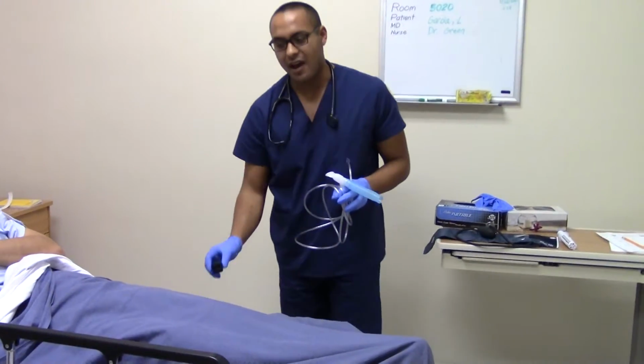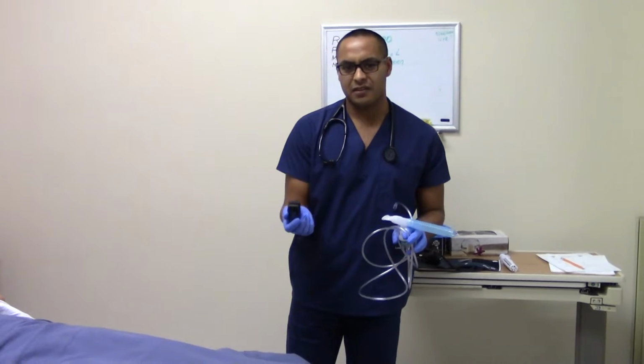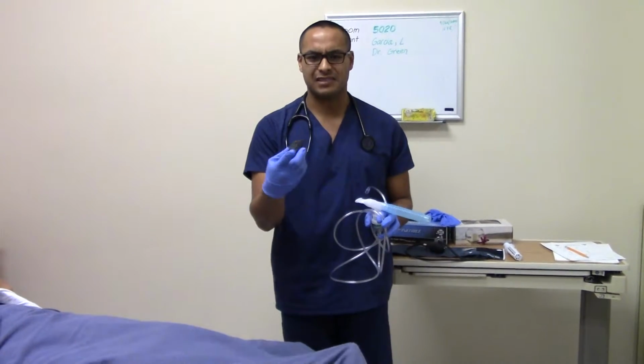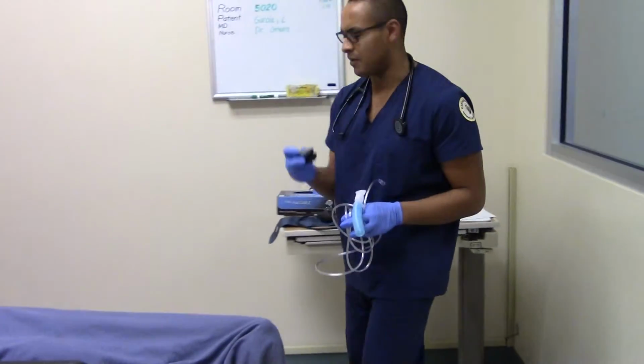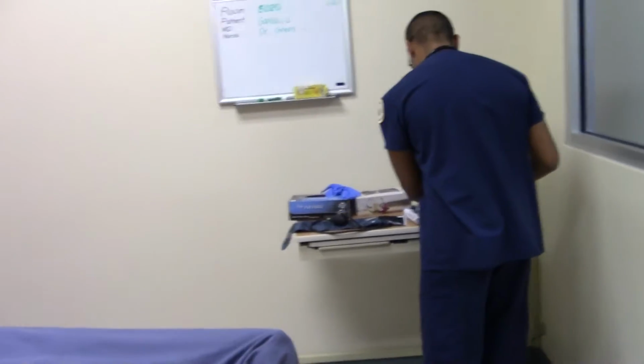Stats went a little high. Actually, it was at 58. It went up to 69. So that's like 12, I think. All right, good job, Christian.